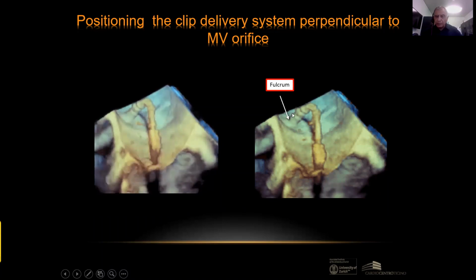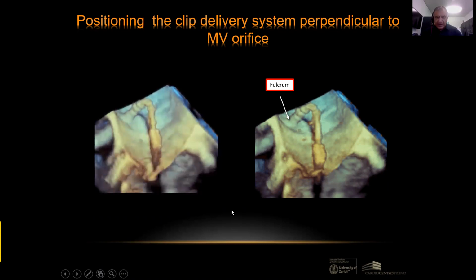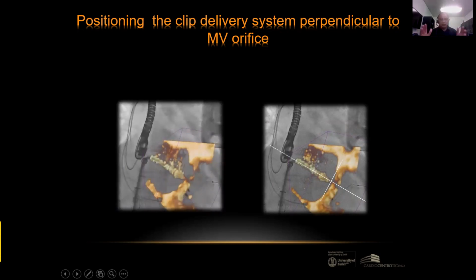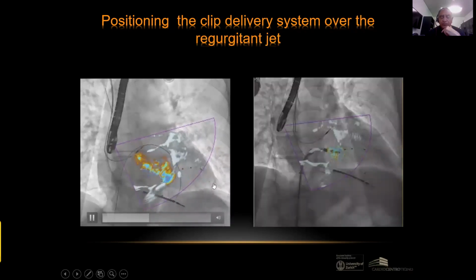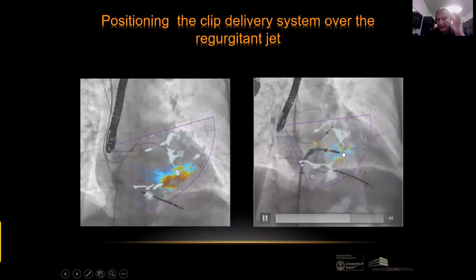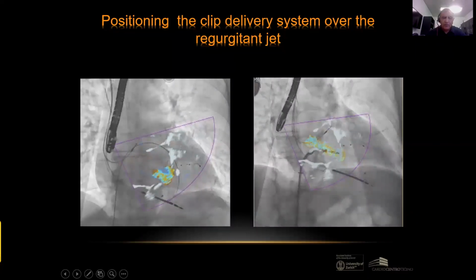Probably the best way to understand that you are perpendicular to the orifice of the left atrioventricular valve is the fusion. With the fusion, you can see very clearly that the catheter is completely perpendicular to the mitral valve annulus, so they can go down, up, and this is a good position. And then, of course, with the fusion, you can see exactly where the point of regurgitation is, and put the catheter exactly over the point of the regurgitation. And this is another very good help for the intervention.